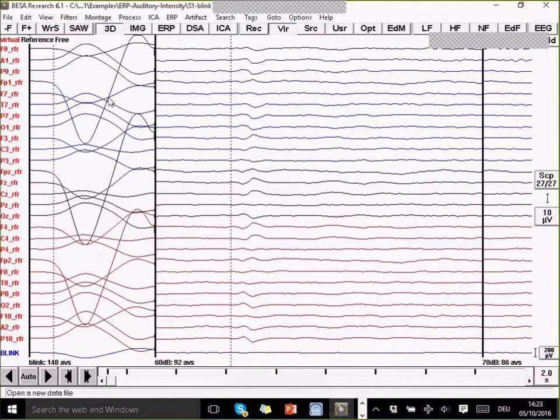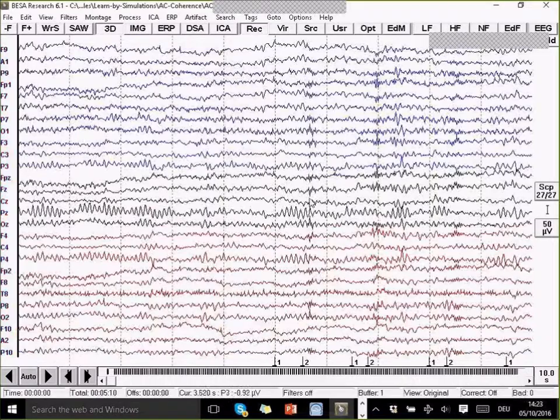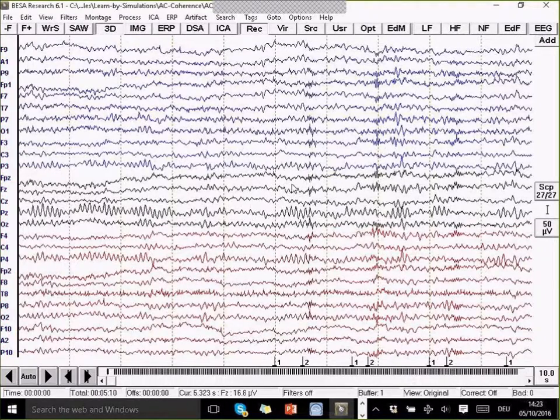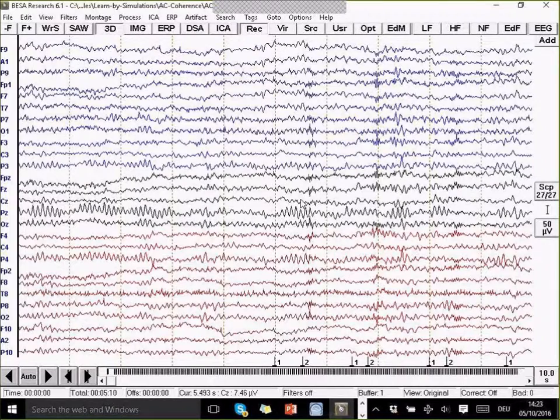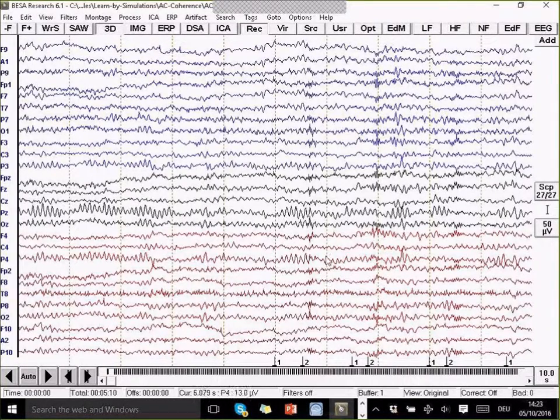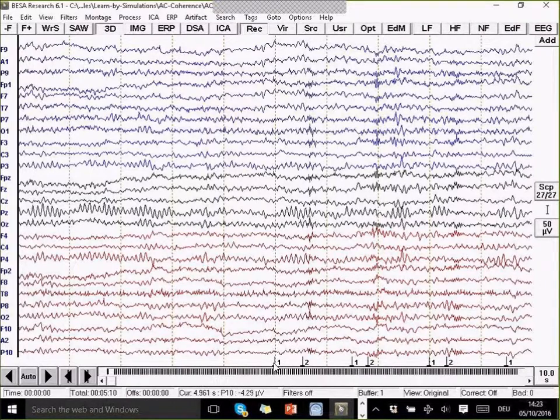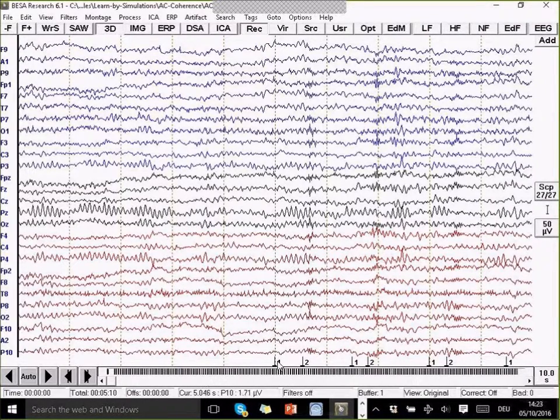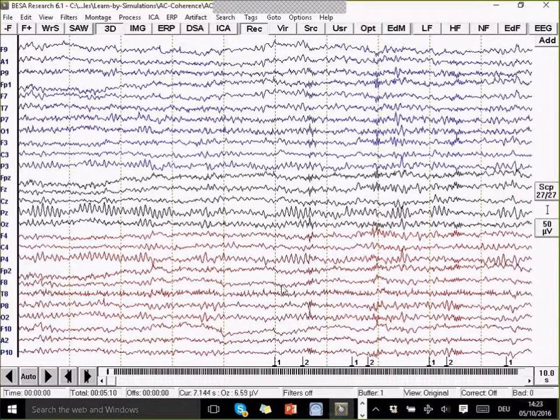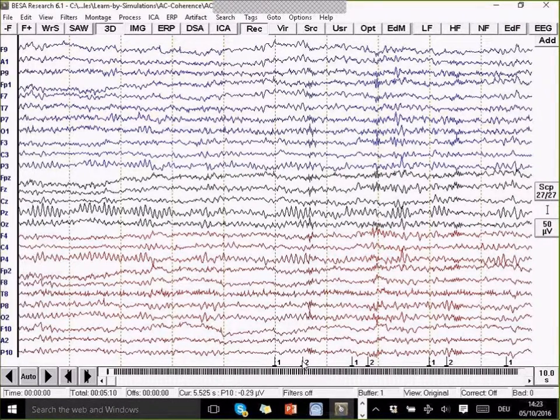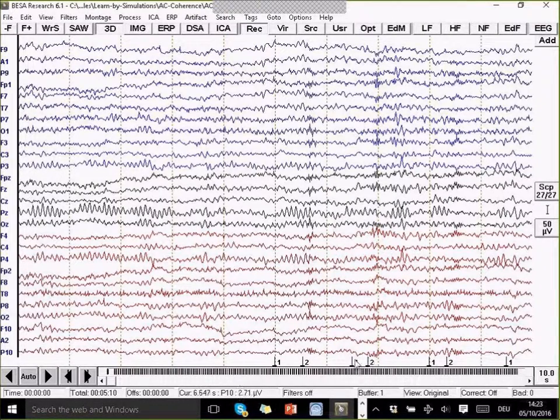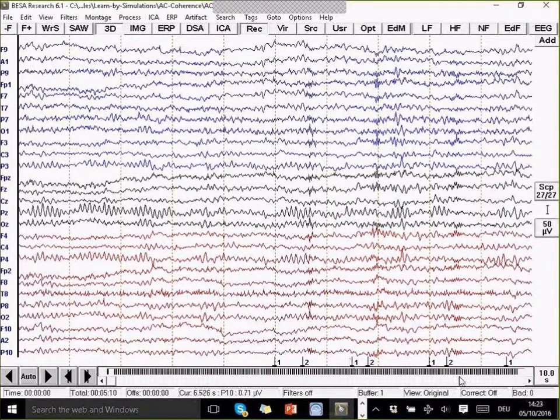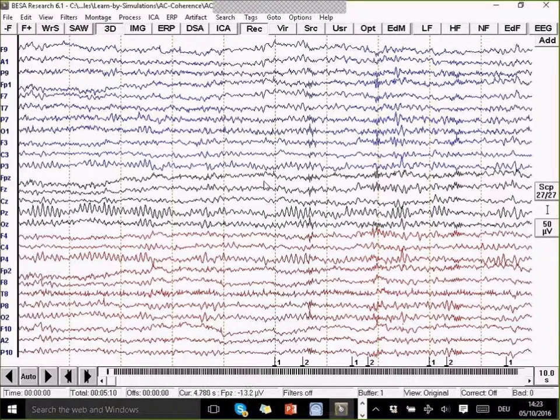This is the raw data. The raw data show just a standard EEG onto which we superimposed our simulated data. Trigger number one is the stimulus, the sent followed by a static response. And the jittering starts at trigger number two. You can see that trigger number two always has different timing with respect to trigger number one.